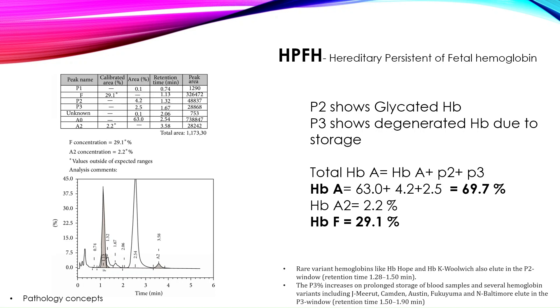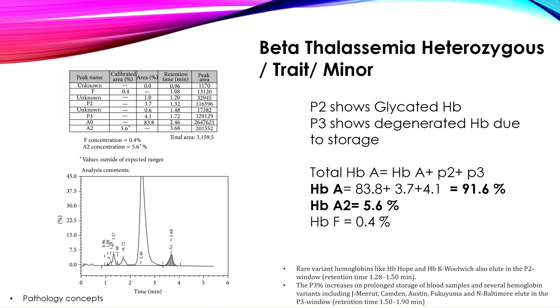Next is HPFH — hereditary persistence of fetal hemoglobin. Here HbA is 69.7%, HbA2 is 2.2%, and HbF is 29.1%. In HPFH, HbF is usually less than 50%.